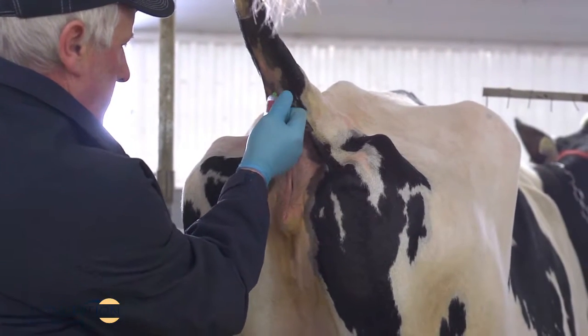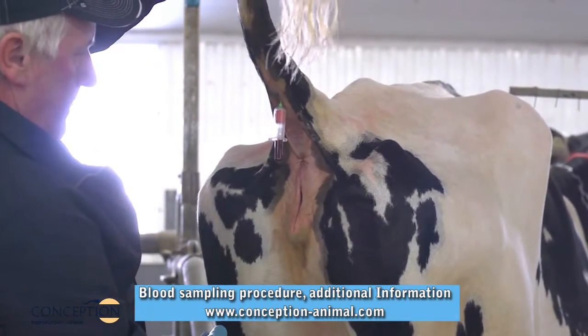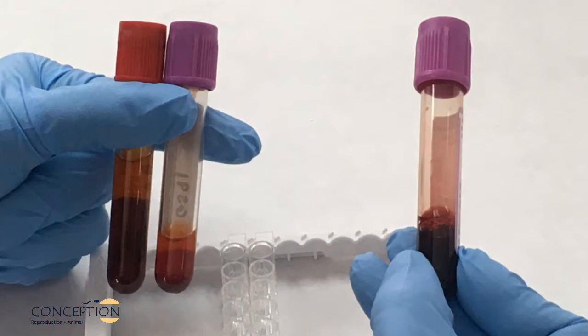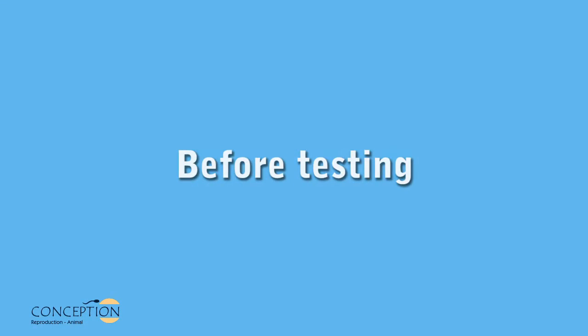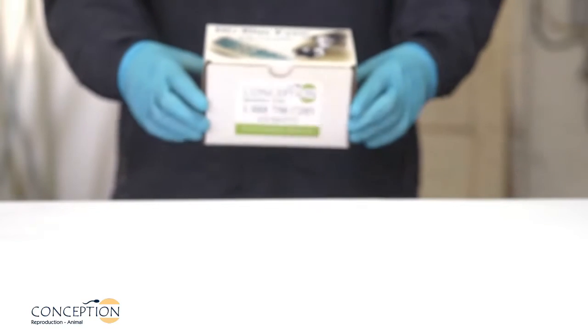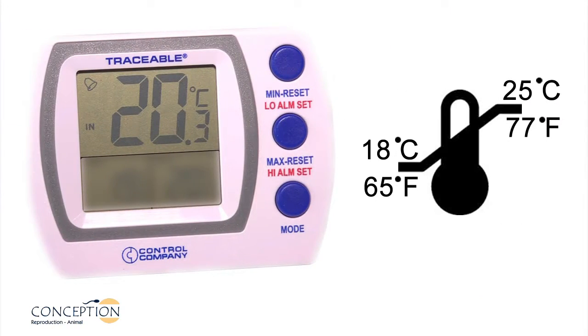Blood samples must be taken from cattle at 28 days or more after the last breeding and at 90 days or more after calving. Serum, plasma EDTA, or whole blood EDTA can be used for analysis. Before testing, bring the DG Blue Eyes kit and blood samples to room temperature one hour before use. During the test, the ambient temperature must be between 18 and 25 degrees Celsius.